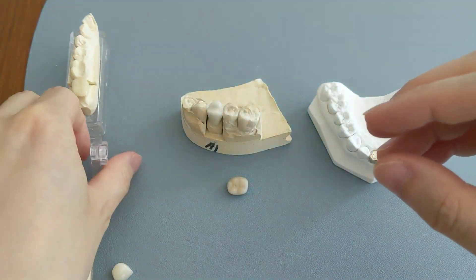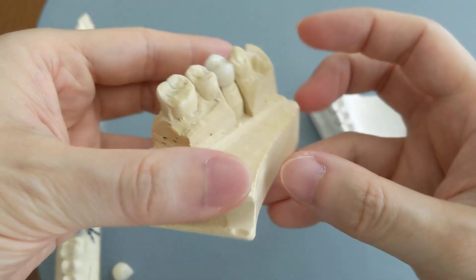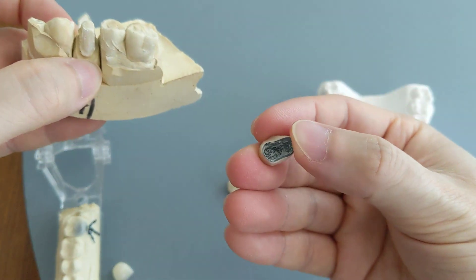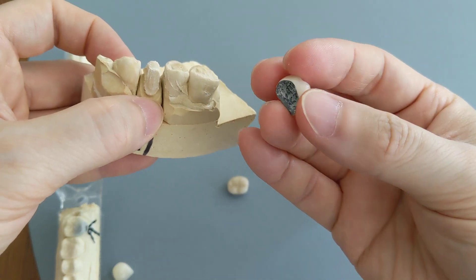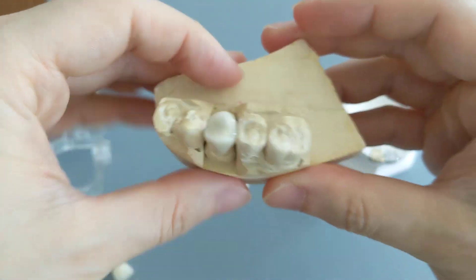Let's move on to the porcelain fused to metal crowns. As the name implies, the outer layer is porcelain and then there is metal underneath of it. Essentially the porcelain is fused over the metal — you can even call it as the porcelain being veneered onto the metal. This one is a premolar PFM crown.